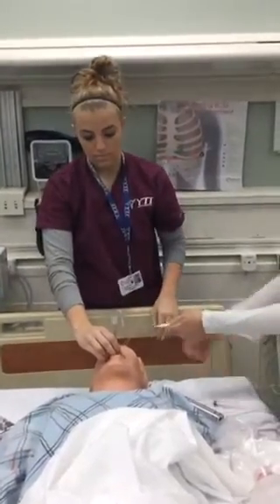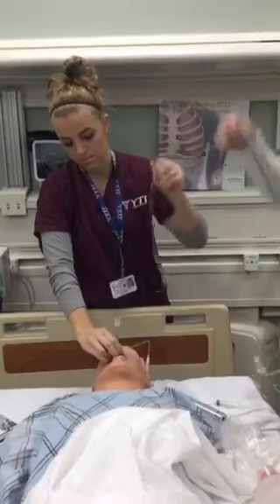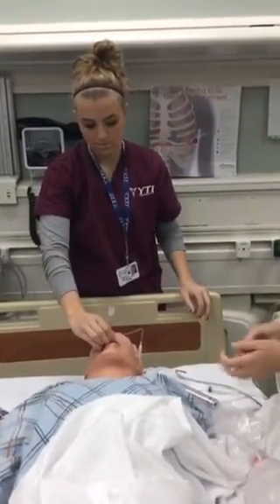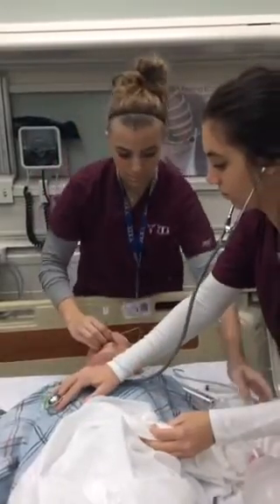Inflate the cuff and listen for equal and bilateral breath sounds. If louder sounds are heard on the right than left, the tube is probably in the right mainstem. Deflate the cuff and withdraw the tube until equal breath sounds are heard.